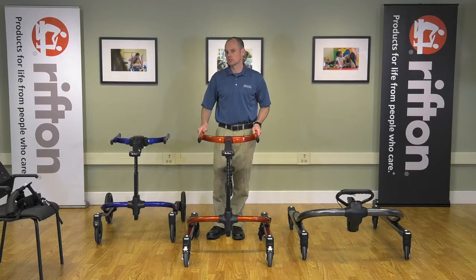I'll have my colleague Juanita explain a little bit more, but I think it's a little hard to get around the wheelchair. The frame doesn't fit around the wheelchair base, so we can't get them close enough to get on the saddle seat. Okay. Well, I could see that being a problem.